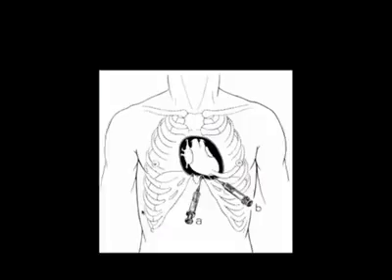There's two particular windows that we use when we perform a pericardiocentesis under ultrasound guidance. That's the subcostal window, which is the more classic window performed usually without ultrasound guidance, and then the apical window, which has gained a good bit of popularity since the use of ultrasound for guiding this procedure. Some people also use a peristernal technique going in the third or fourth intercostal space. However, I prefer not to use this due to the location of the left anterior descending artery. The concept of lacerating that artery just sort of scares me.